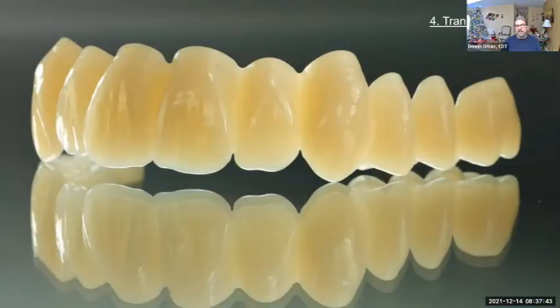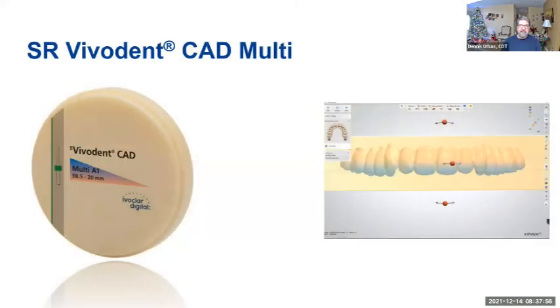Same slides here. And there's that full arch mill of the denture teeth. Look how nice it is. So all we have to do now is take this full arch and bond it into the denture base. And then we do the final mill and we're ready to go. Then they have something called the Vivodent CAD Multi.